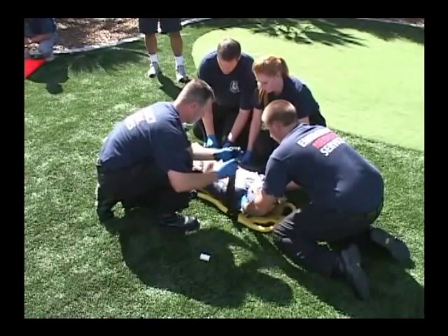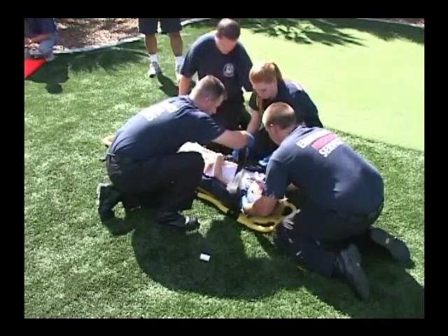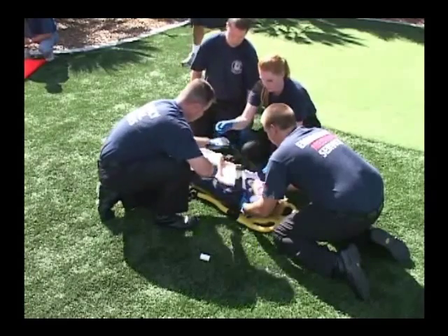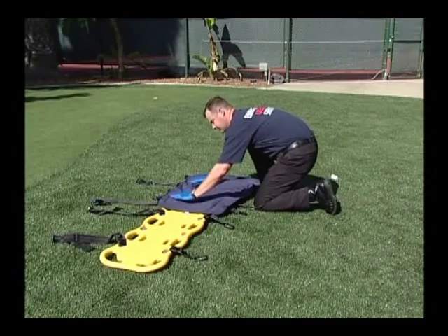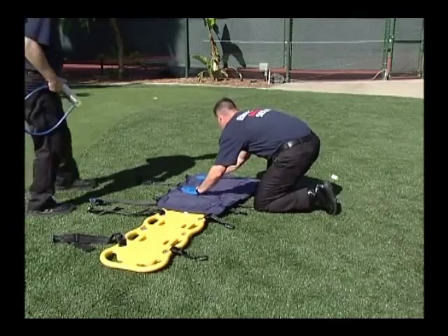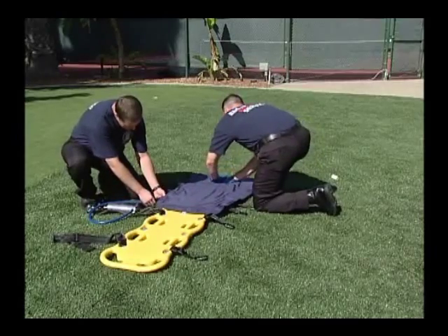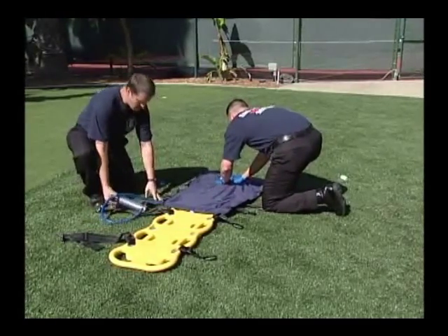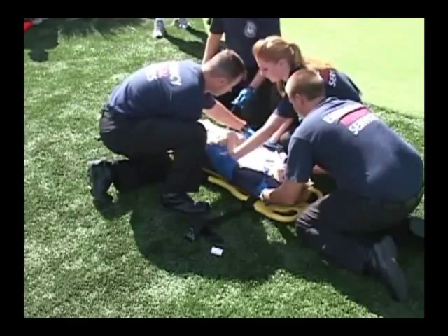If your pediatric vacuum splint or other pediatric immobilizer is not available, try using the evacu-splint as a pediatric immobilizer in conjunction with a standard backboard. Lay the evacu-splint on your backboard just as we did for the head immobilizer application. Remember that depending on the patient's age, your patient may need more padding under the torso than under their head. Spread out the beads to meet the needs of your pediatric patient. Place the patient on the evacu-splint according to your local medical protocols.